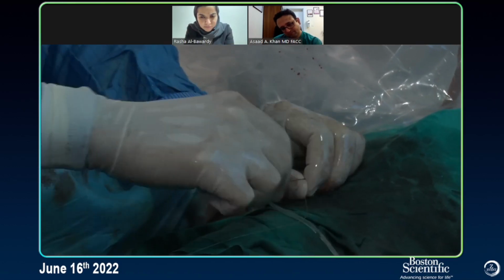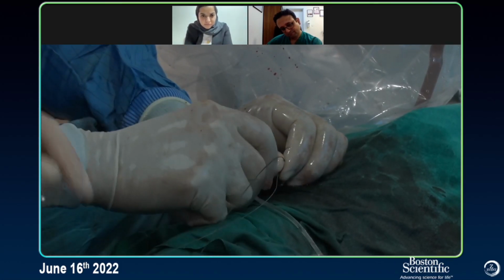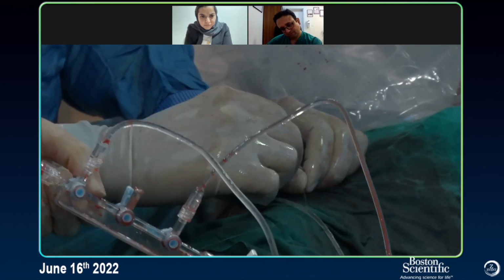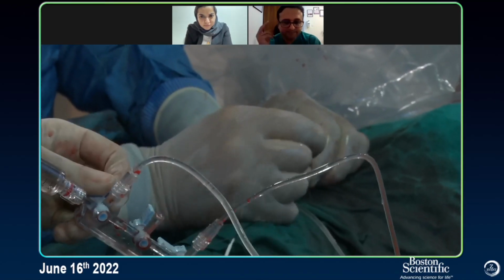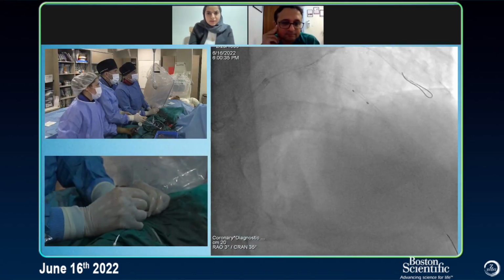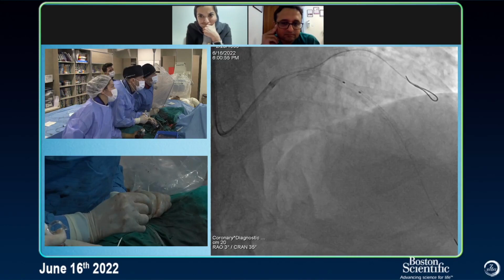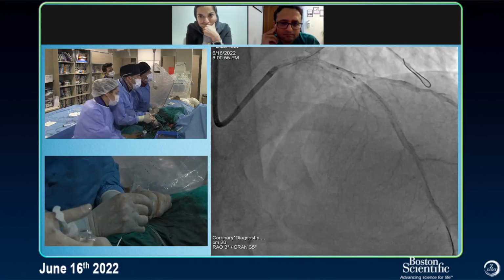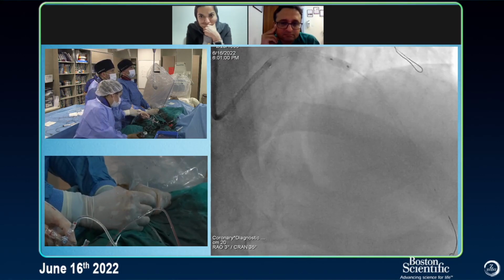Cranial. Önce cranial. We can see the 4-0 falan. Let us see here. Yes, exactly. Let's do it here. Okay. 10, 12, 14.